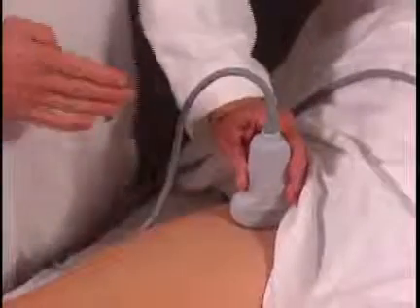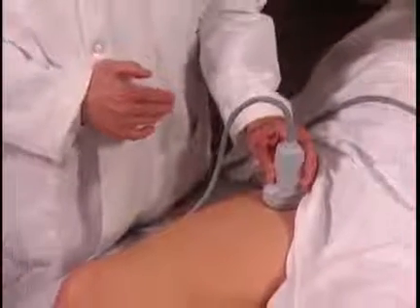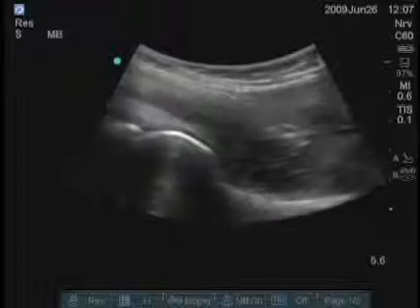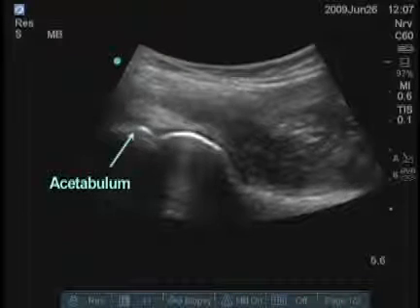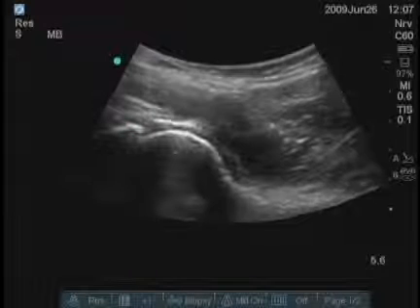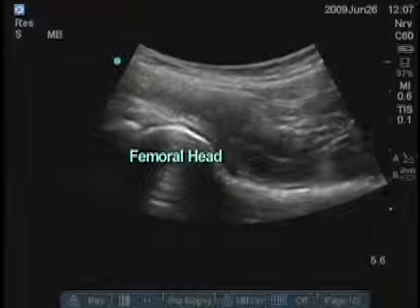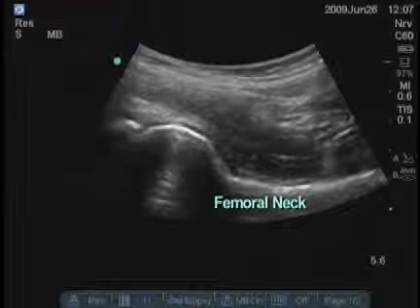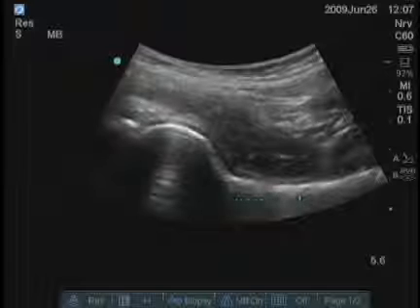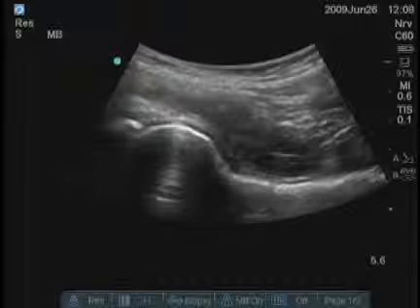I'm trying to align the transducer approximately parallel with the femoral neck. On the left side of the screen, the hyperechoic line is the acetabulum. The curved or circular structure is the femoral head. It then drops down to the femoral neck, and we can see the femur itself extending parallel to the top part of the image out toward the right.